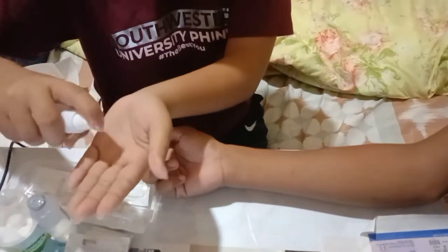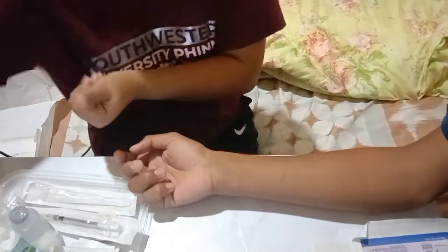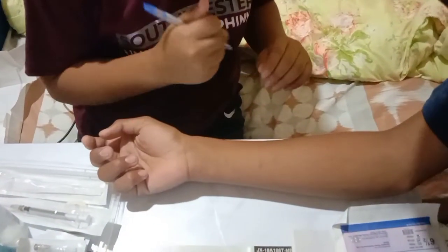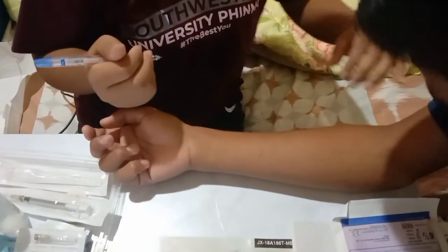Perform hand hygiene after the injection. After that, circle the injection site with ink to observe for redness or induration per agency policy.